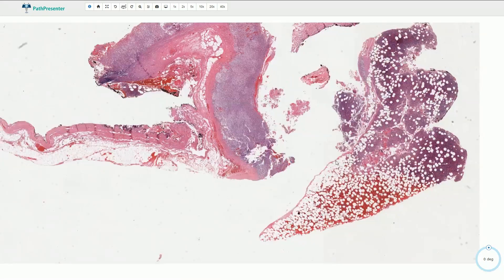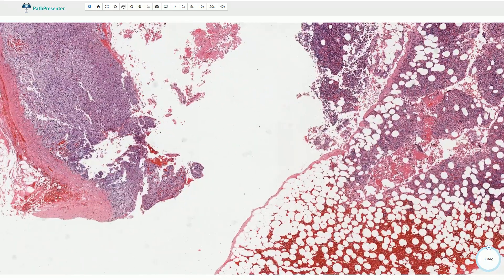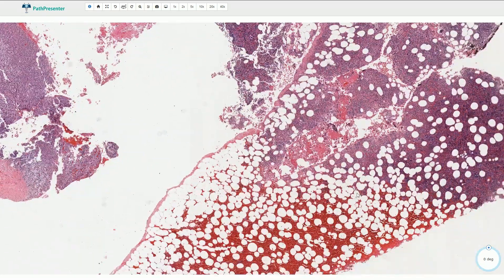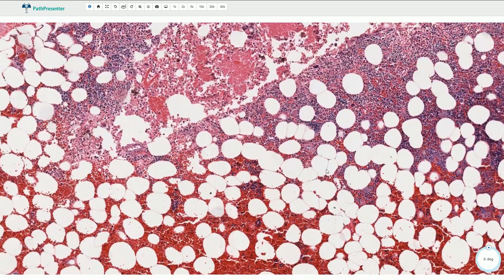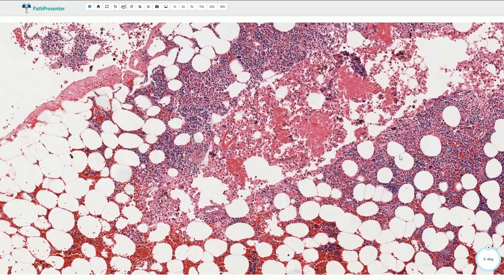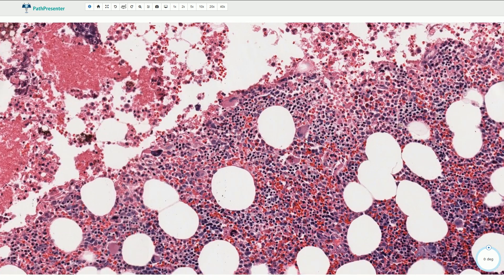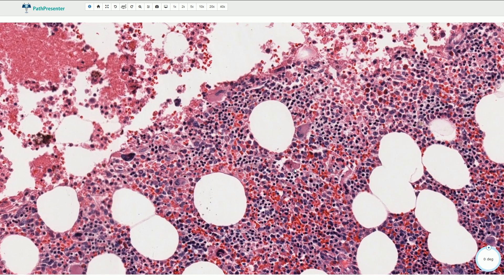On higher magnification, we have a component composed of adipose tissue — we can see all these mature adipocytes that are completely normal and bland. If we zoom in, we can see some megakaryocytes: these larger cells with eosinophilic cytoplasm and lobated nuclei.